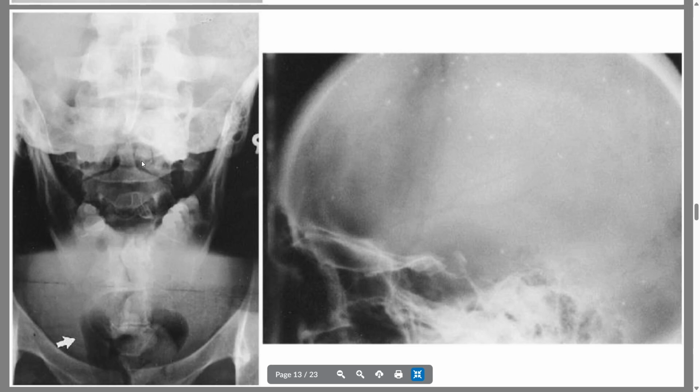On the left here, this is one of the x-rays that you'll actually be taking next semester, that we'll be learning how to perform. This is an APOM or an odontoid view where we're looking at the upper cervical spine. It's called APOM because it's A to P and OM stands for open mouth. So you can see their mouth is open, they have their teeth here, and we're looking at that C2 vertebral body. Great. So what is a pelvis doing here?